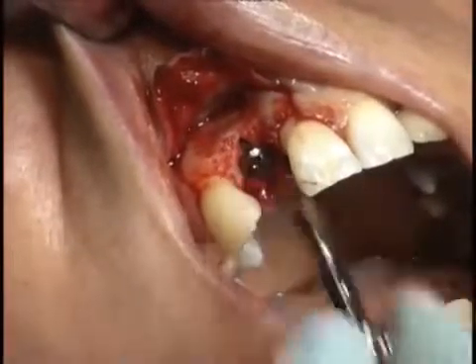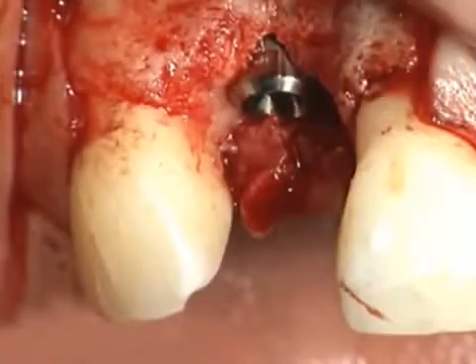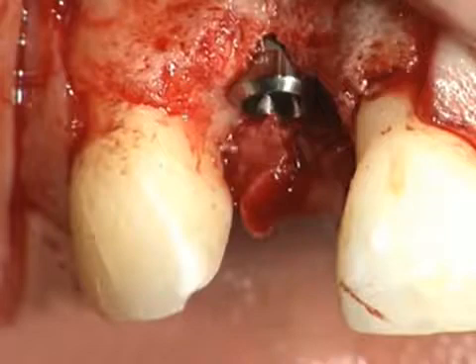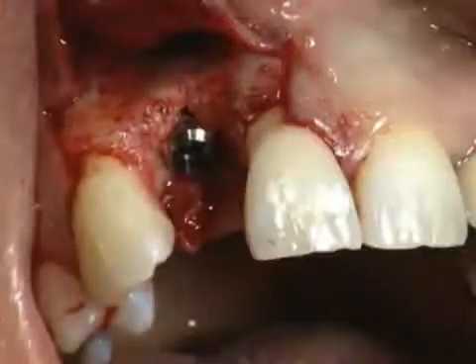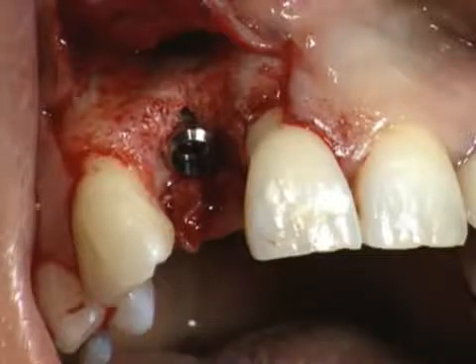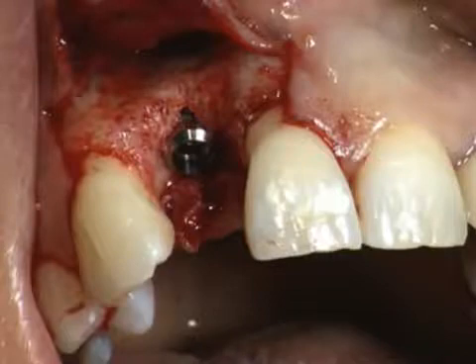The final vertical position is reached when the implant shoulder is situated at the same height as the enamel cementum margin of the adjacent teeth. The implant should be surrounded by a layer of bone at least 1 millimeter in thickness. The small marginal recession is later augmented with autologous bone chips.